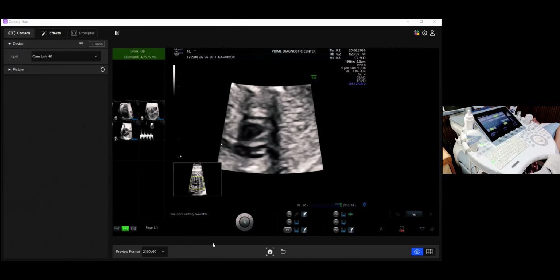We'll quickly scan another patient, and if we are able to get the bicaval view, we'll show you. So the issue is that with the things which you don't do so frequently, you struggle. But if we include the bicaval view in all the patients, then maybe we would develop some quick fixes for that. But let me see in the next patient.